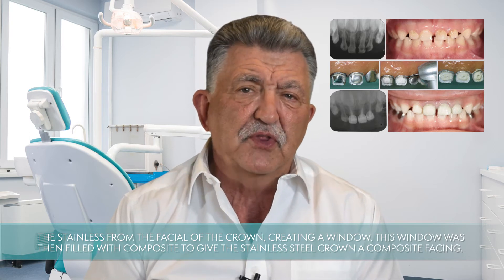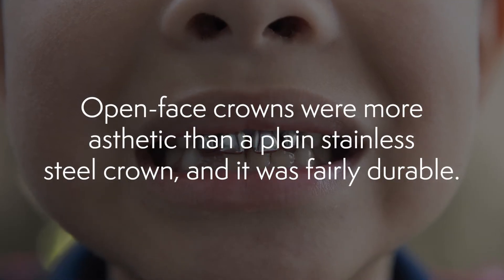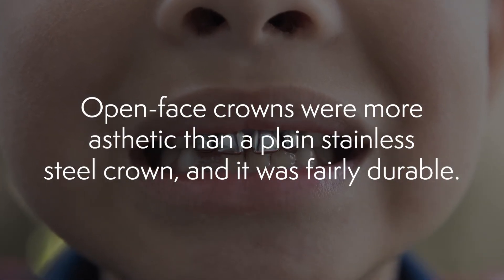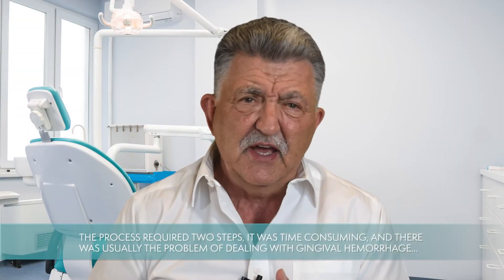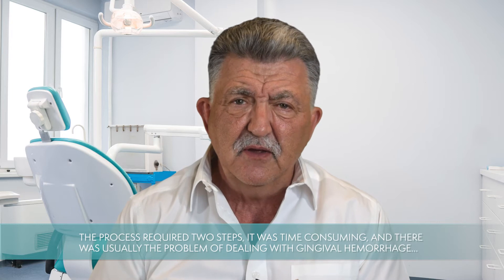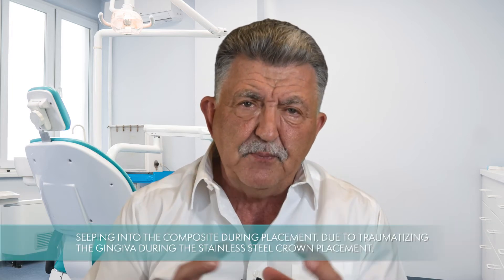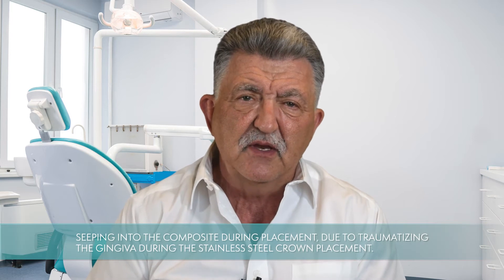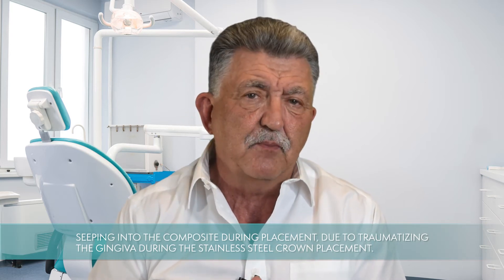An open-faced crown was done by cementing a stainless steel crown on primary incisors, then using a high-speed carbide burr to cut away the stainless steel from the facial of the crown, creating a window. This window was then filled with composite to give the stainless steel crown a composite facing. This was more aesthetic than a plain stainless steel crown and fairly durable, but it required two steps, was time-consuming, and often involved gingival hemorrhage seeping into the composite during placement. The aesthetics still weren't all that great.